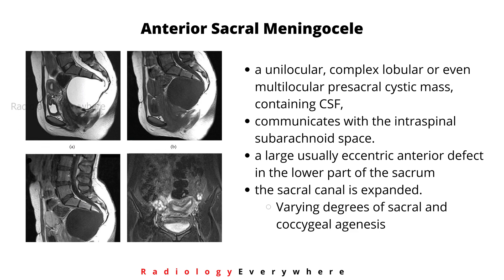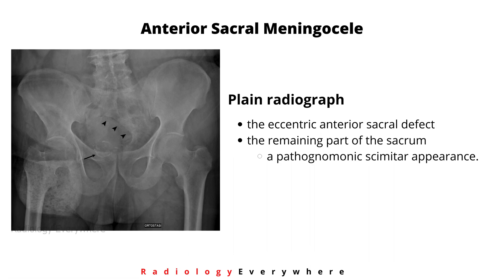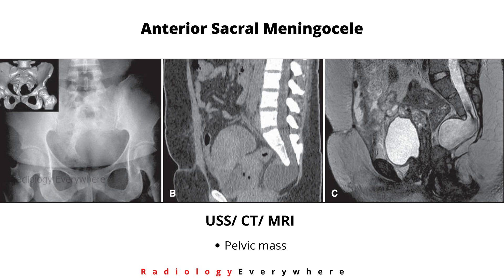The sacral canal is expanded and you can see varying degrees of sacral and coccygeal agenesis. When considering imaging, on plain X-ray you can see the eccentric anterior sacral defect, and the remaining part of the sacrum is visualized as a pathognomonic scimitar appearance.